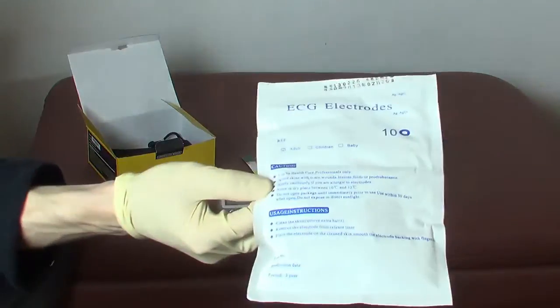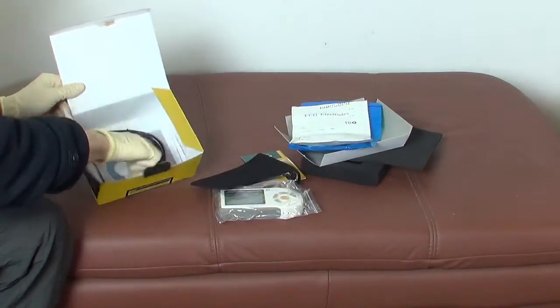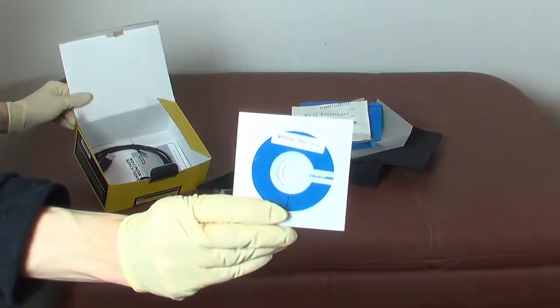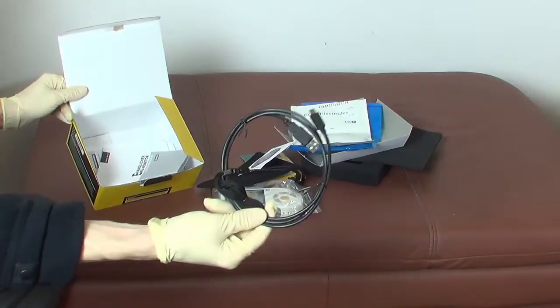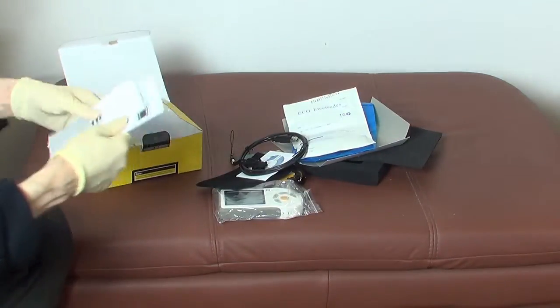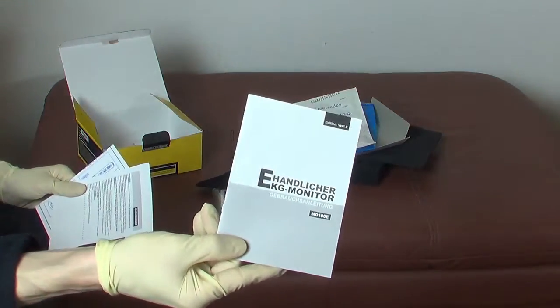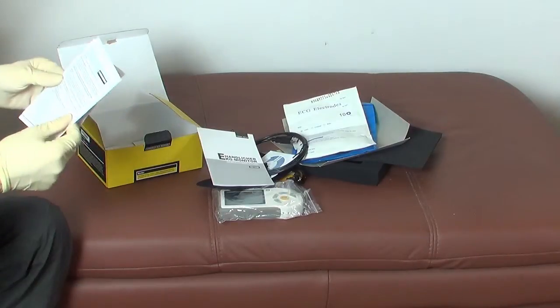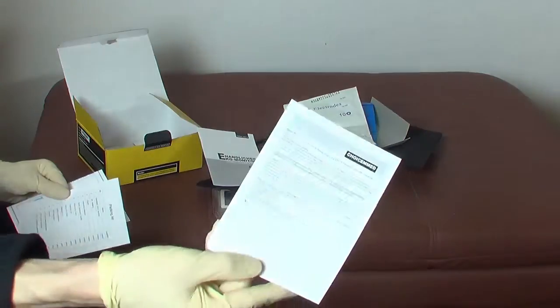In order to correctly interpret the ECG waveforms, you definitely should buy a book which explains how a healthy heart would look like. Interpreting the signals is all about experience, and when you start recording your own signals over time under idle conditions and under stress conditions, you will finally learn what these signals actually mean.